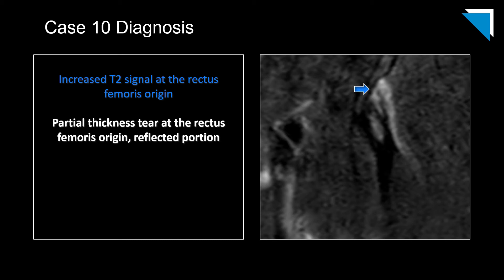This is indicative of a partial-thickness tear of the reflected portion of the tendon. When we talk about avulsion injuries of the rectus femoris tendon at the anterior inferior iliac spine, we are talking about the direct portion of the tendon. There is also a reflected portion of the tendon, which originates more superiorly along the lateral aspect of the acetabulum.